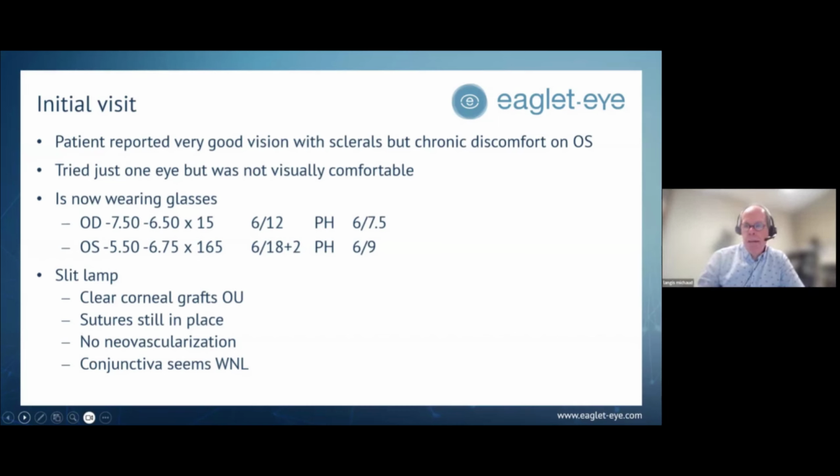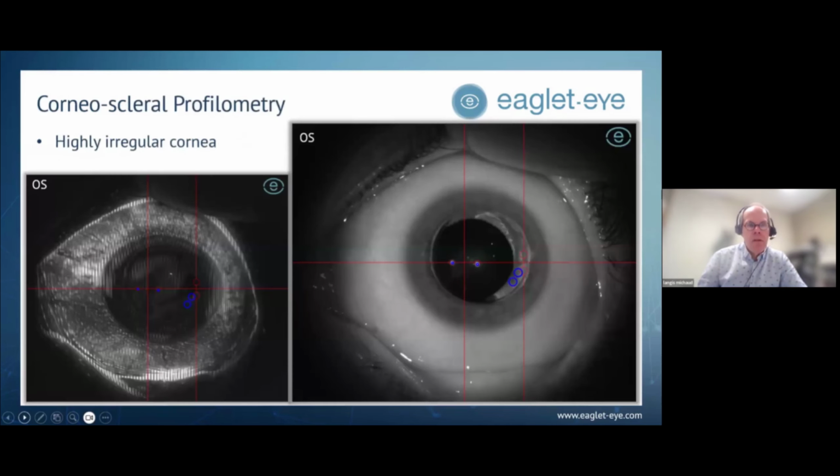It may be surprising, but some corneas that seem to be really weak will do very well with scleral lenses. Some other corneas that seem to be very healthy will have a complete failure. I saw a graft becoming opaque in a matter of 2 hours after scleral lens wear. So it happens, and it's a fragile cornea, and we have to look at that. But in that case, I had no concern to start with.